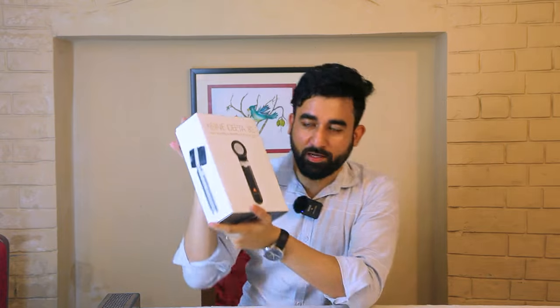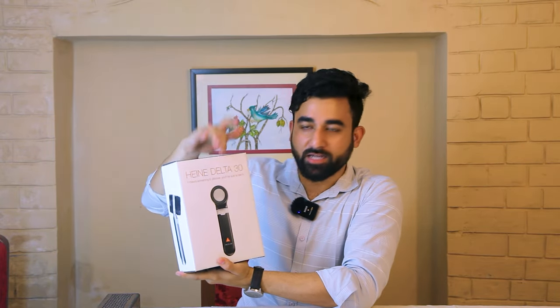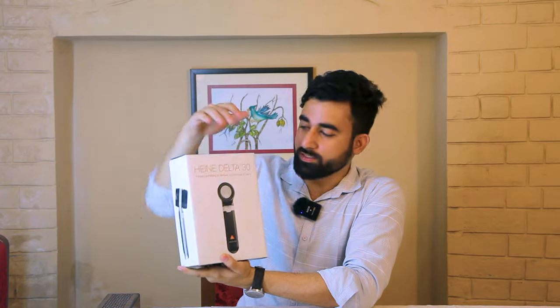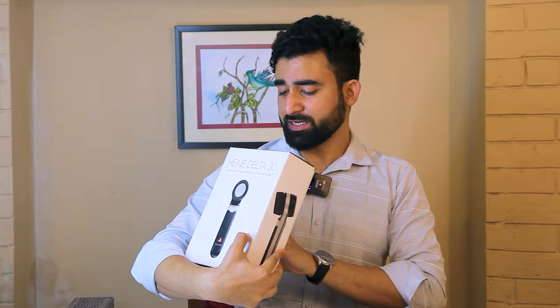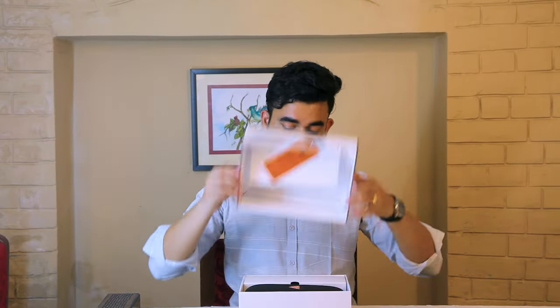On the center of the box you can see the Heine Delta 30 name and its photo. The box quality is very good. Heine's website details are written on it, along with its SKU numbers which is the product code, and Heine branding is displayed. Let's open the box — it is a very premium, full package.